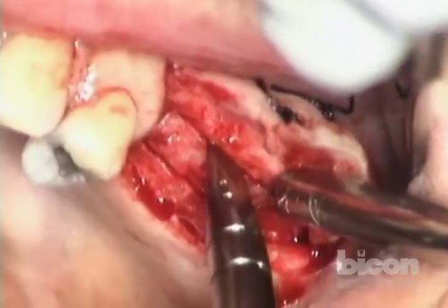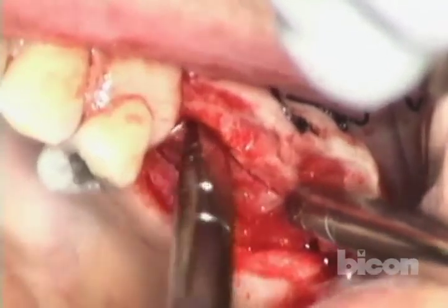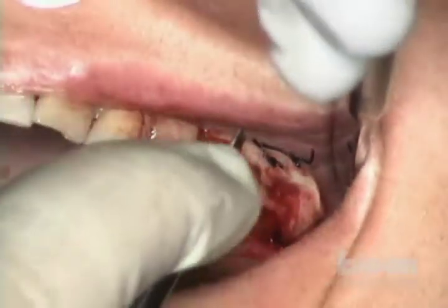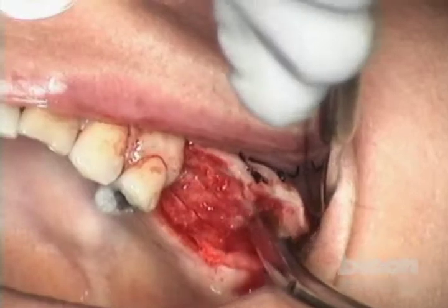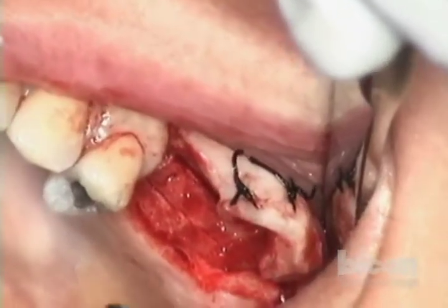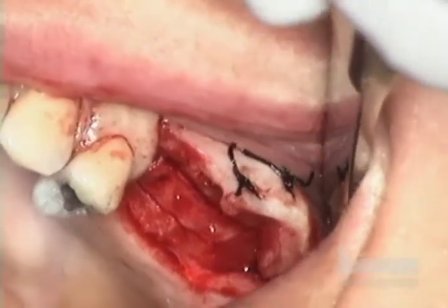Now we will show you a picture of this rectangle in a minute. Incidentally, the markings on your osteotomes are at six and eight millimeters. By staying within about the middle of the distance — about three millimeters — which is the thickness at the thickest part in there. Now we're going to elevate this floor by completing the fracture. For that we will use the sinus osteotomes available in the Bicon kit — we start with three and a half, two and a half, or four, whatever fits best within the confines of that rectangle.